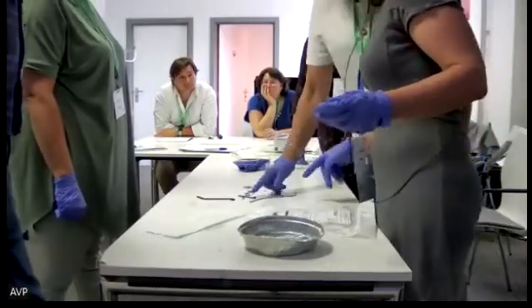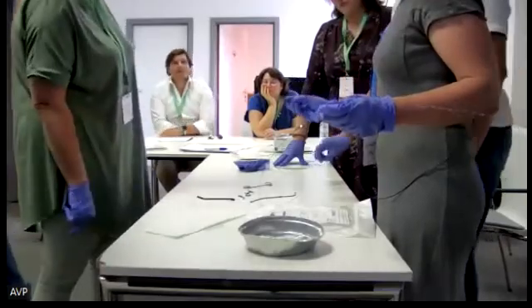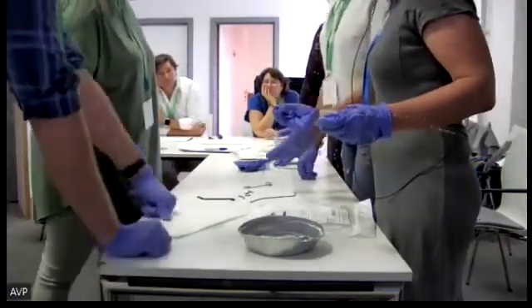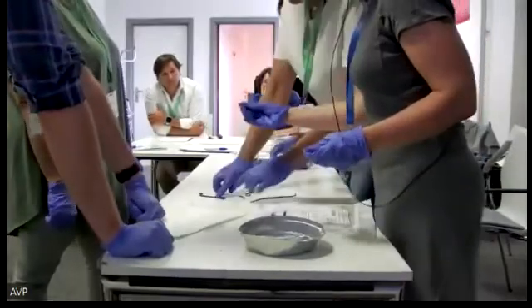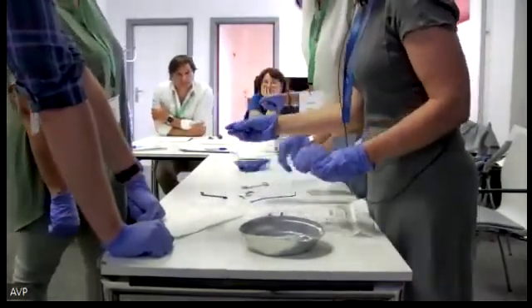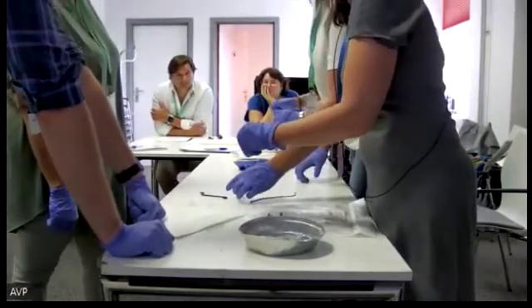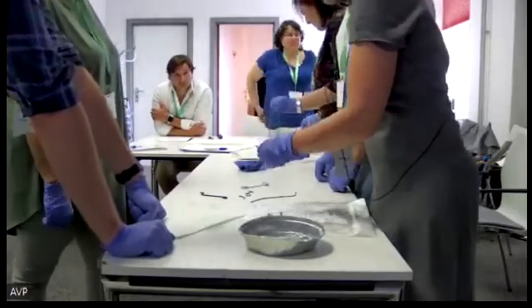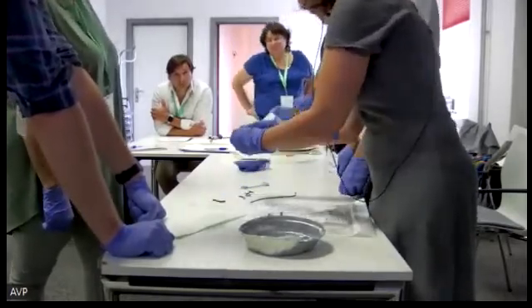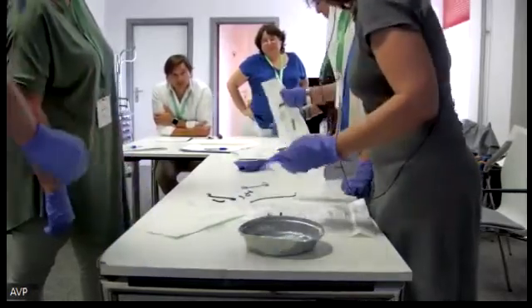Il faut les couper, parce que ça perfore. I don't know what it is. We don't use that kind anymore. It was an old stent, but usually you have to check out the duodenal extremity, because you might have to cut a bit to trim it, because this is too long and can be traumatic for the contralateral duodenum. Same for this. So usually we cut it a bit like this, trois quarts.